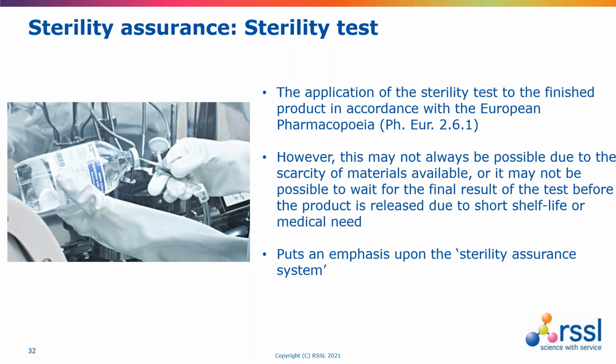Again, just touching on the sterility test, sterility assurance aspects, because of the weaknesses with the sterility test in terms of numbers of samples, in terms of recovery of stressed organisms, around incubation time, then this connects with the whole Annex 1 strategy of a robust sterility assurance system and drawing more inferences from that totality of data rather than over dependence upon a single release test.